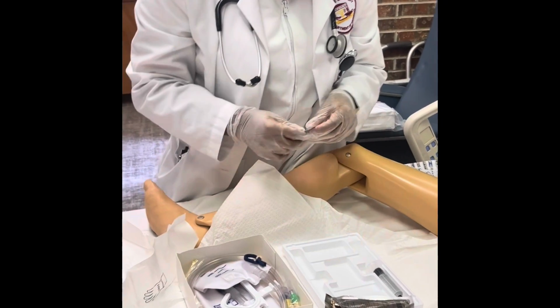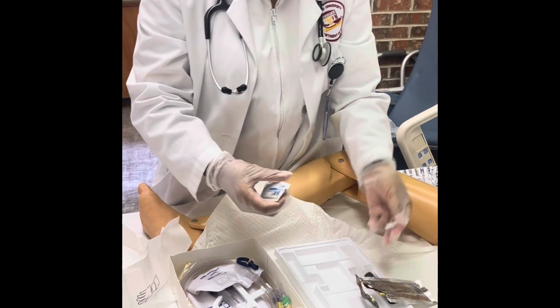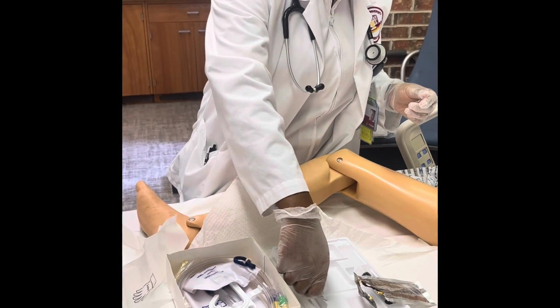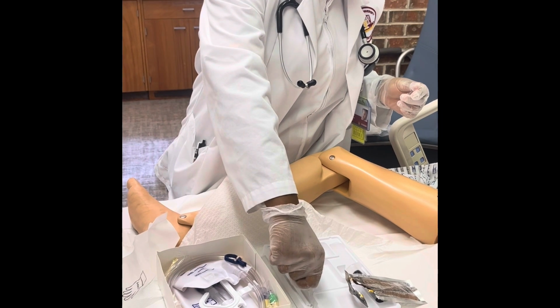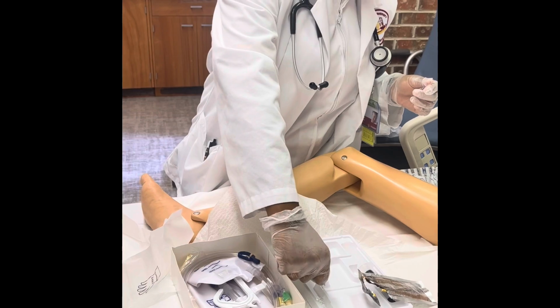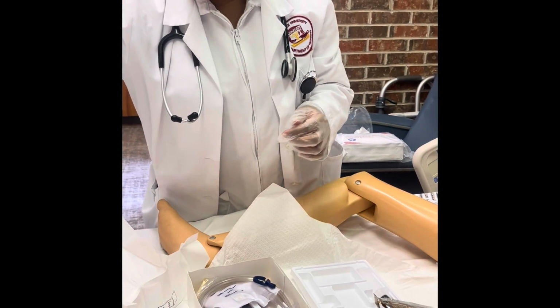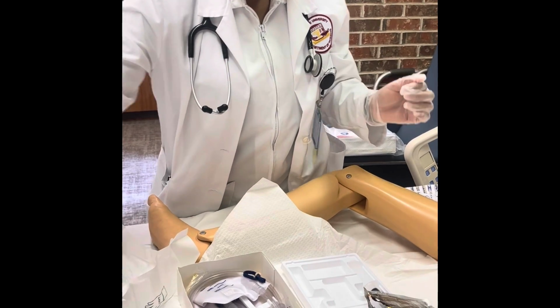Open up my lube. I'm gonna put this lube on the catheter so it's easy to go into the patient. Trash as best I can.